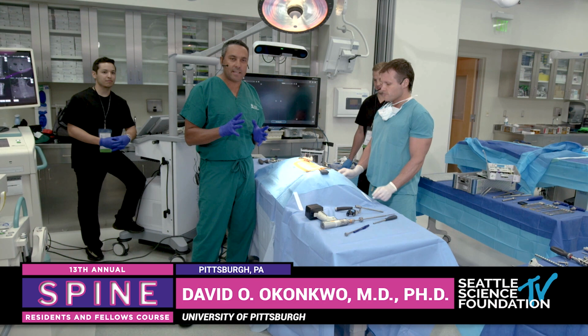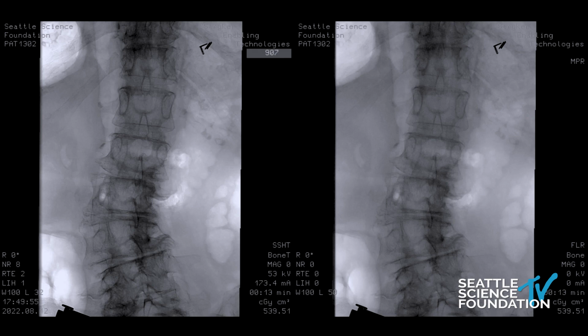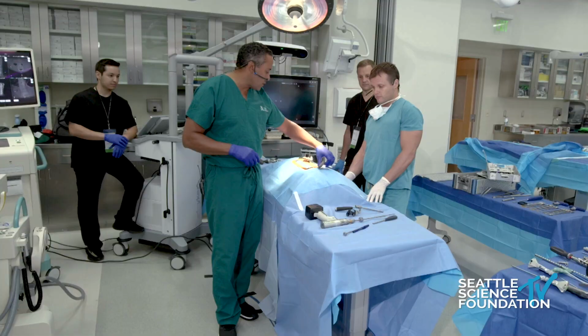So look, we're going to do percutaneous instrumentation, but I want you to point out a couple of things. First of all, we are about to do this, and none of us are wearing lead. So here's the AP of the cadaver that we have. We have been handed something with a higher degree of difficulty because this particular cadaver does in fact have scoliosis. So that's fun for us.